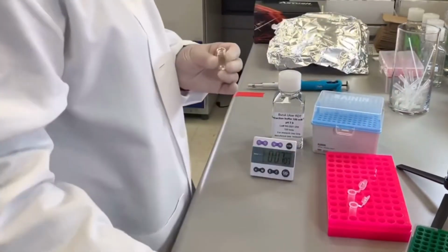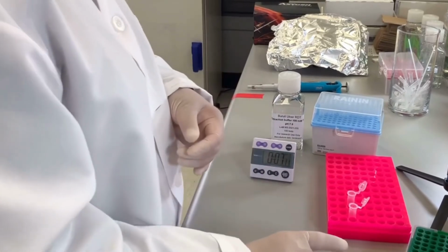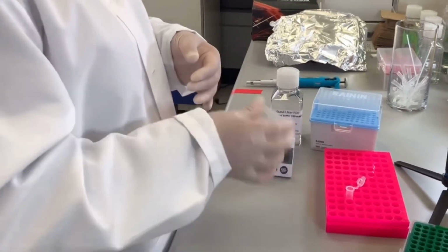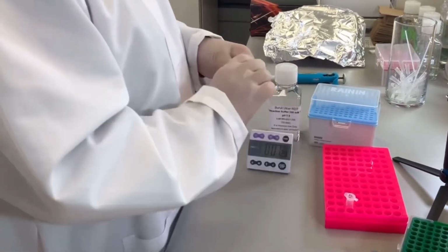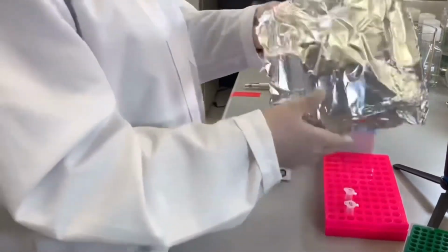You may have noticed that from the positive and negative controls, we are using only 40 microliters, while here we are recommending to use 50 microliters. The reason is other protein compounds in the extracted collection from Buruli wounds might interfere with the test, and the test line intensities might appear weaker than with the positive and negative controls. Then proceed with the test as before.